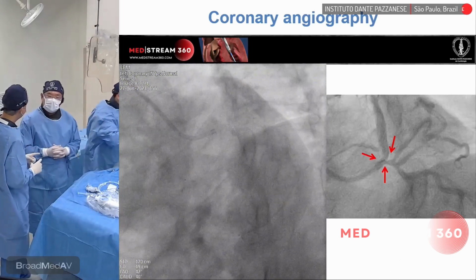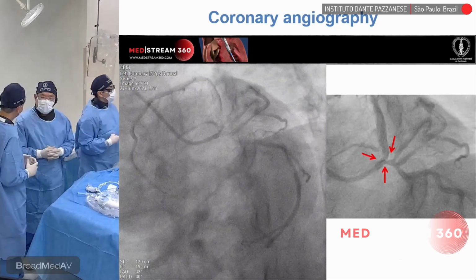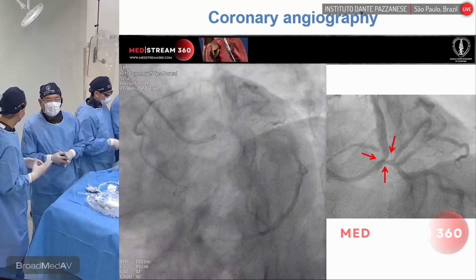So in a case like this, is it applicable to consider physiology or imaging, or do you feel already confident enough to say, no, I have to treat this and I'll target first what I think is the worst lesion?